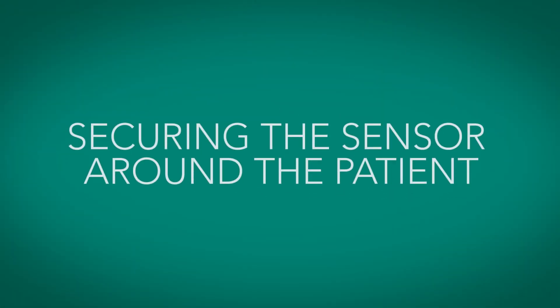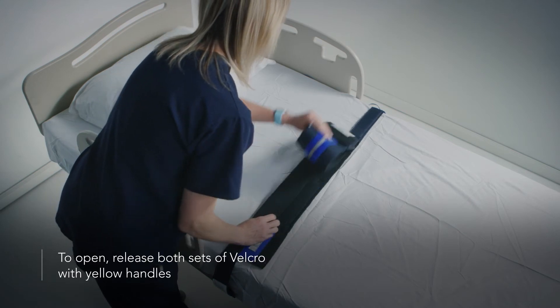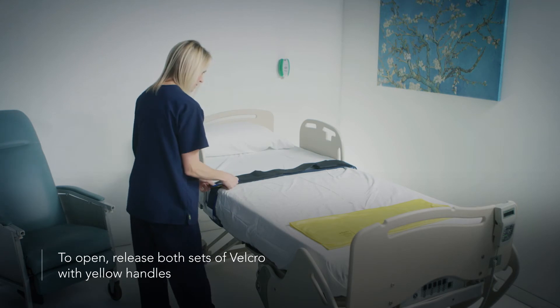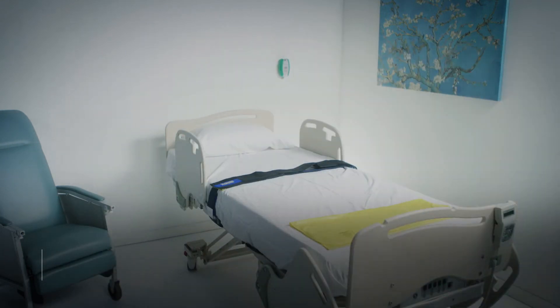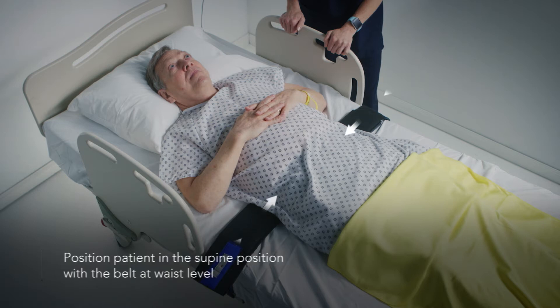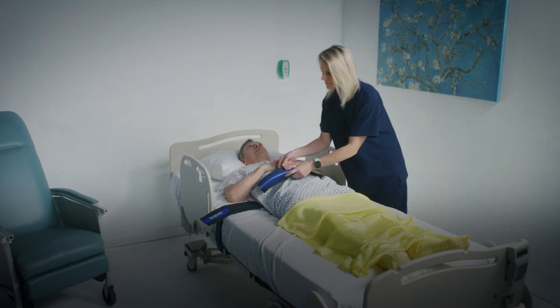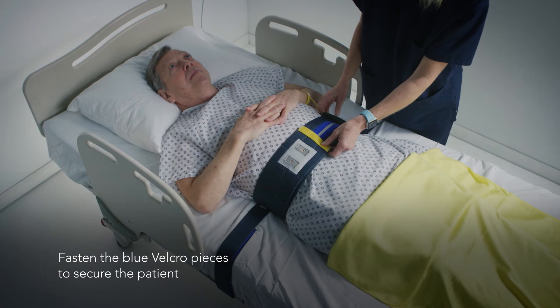Now we'll review how to secure the sensor around the patient. To open, release both sets of velcro with the yellow handles. Position the patient in the supine or face-up position on the center of the bed with the belt at waist level. The patient's garments should cover the skin to avoid direct contact with the device. Secure the belt around the patient by fastening the blue velcro pieces. The belt should fall just above the hips or at the narrowest part of the waist, and should be snug but not cause any discomfort to the patient.